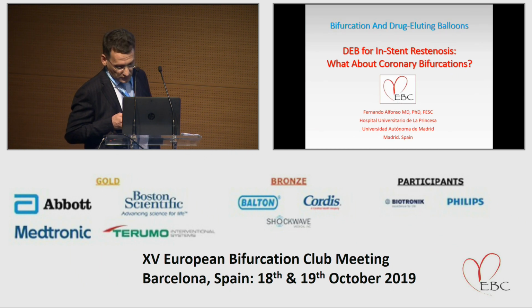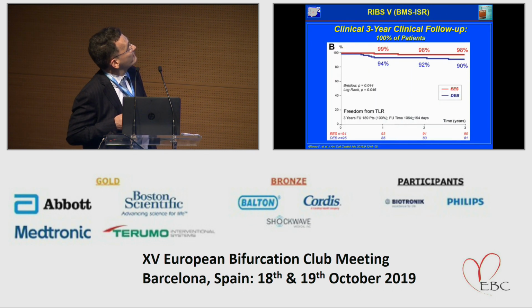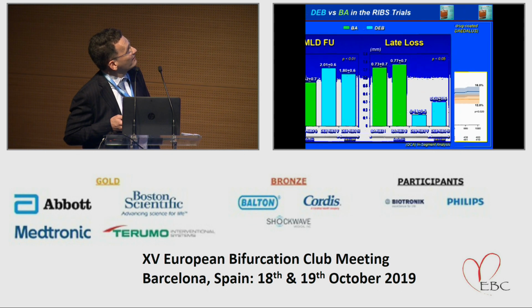Dr. Alfonso expanded on the perks of DEBs for in-stent restenosis, deriving data from the vast array of RIBS trials, either bare metal ISR or DES ISR, or the comparison of DEB versus usual balloons in the RIBS trials.